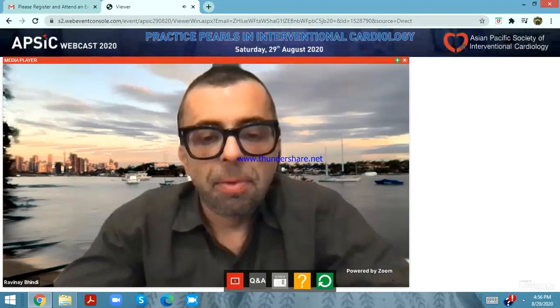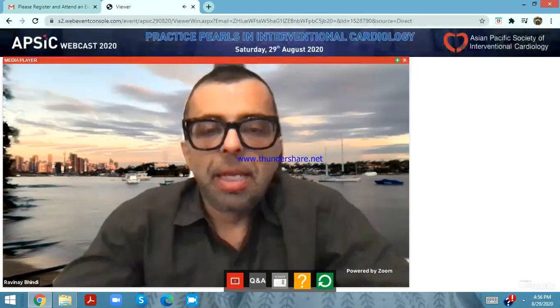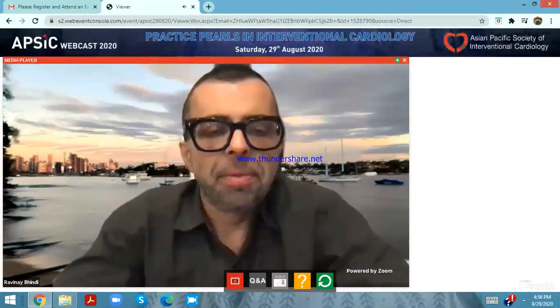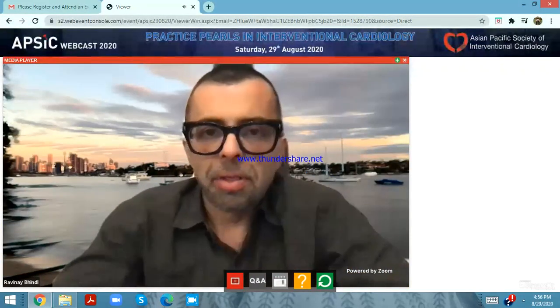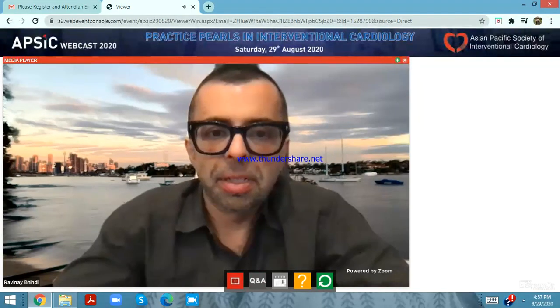For 2 or 3 years we were exclusively using super high pressure balloons with good results, and now that we've got lithotripsy, it's changed the safety paradigm a little. So I'd be intrigued to hear from the rest of you how you choose the various devices in your practice.